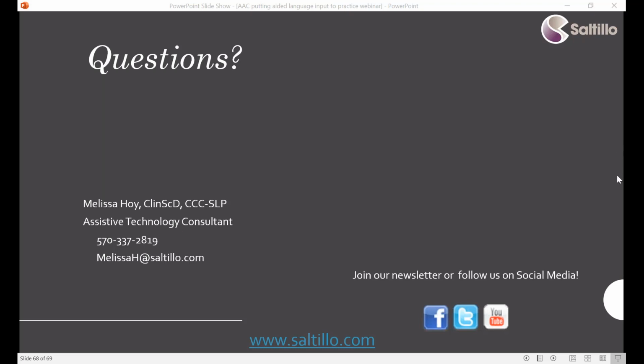I think some of it just comes down to exposure and being comfortable exploring, making mistakes, and finding those words. For example, to reach "eat red apple." Again, I think that comes down to your device. If you're using something like Word Power, for example, "eat" is going to be on your home page, and then it takes you directly to those words. But again, it really is a matter of just being comfortable with the device.